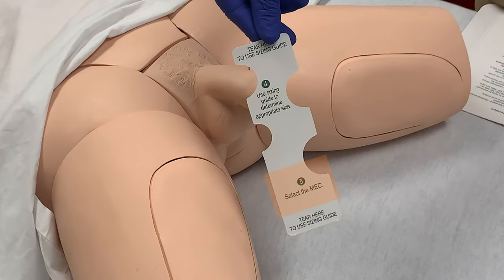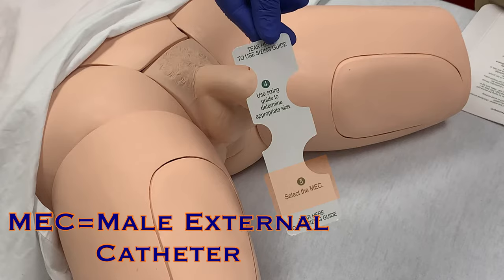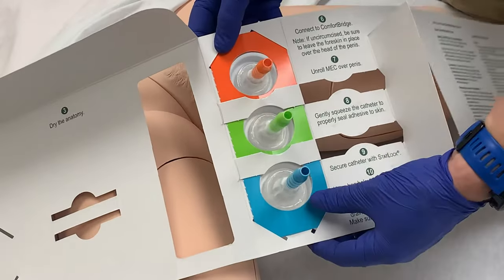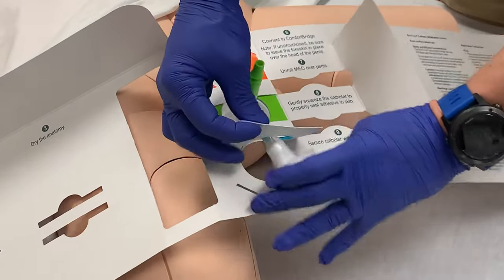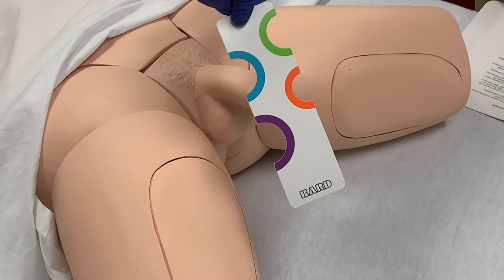Step five is to now select the appropriate MEC, or Male External Catheter. Remove the blue catheter from the tray. The kit includes orange, green, and blue catheters, as those are the most commonly used sizes. The sizing guide also shows a purple catheter. If the patient fits this size, the catheter will need to be ordered from distribution.